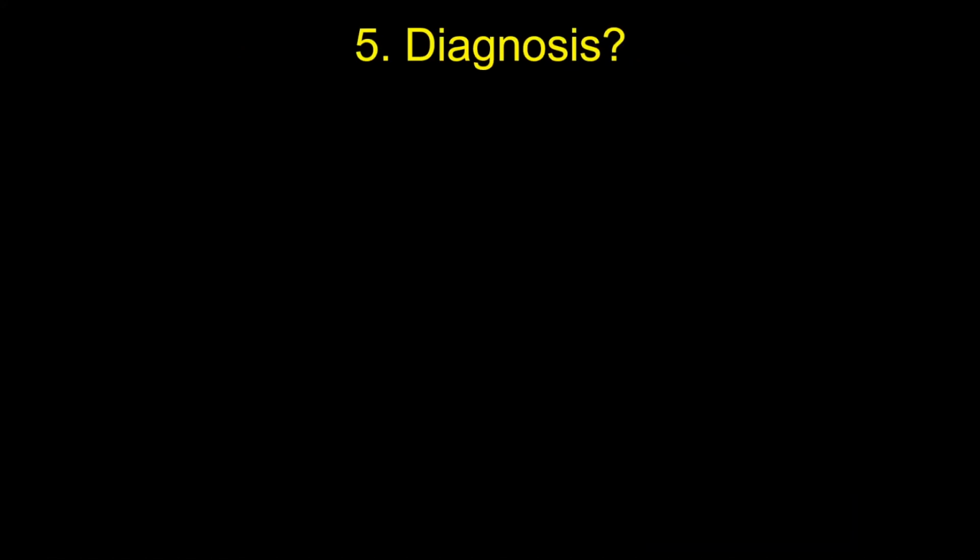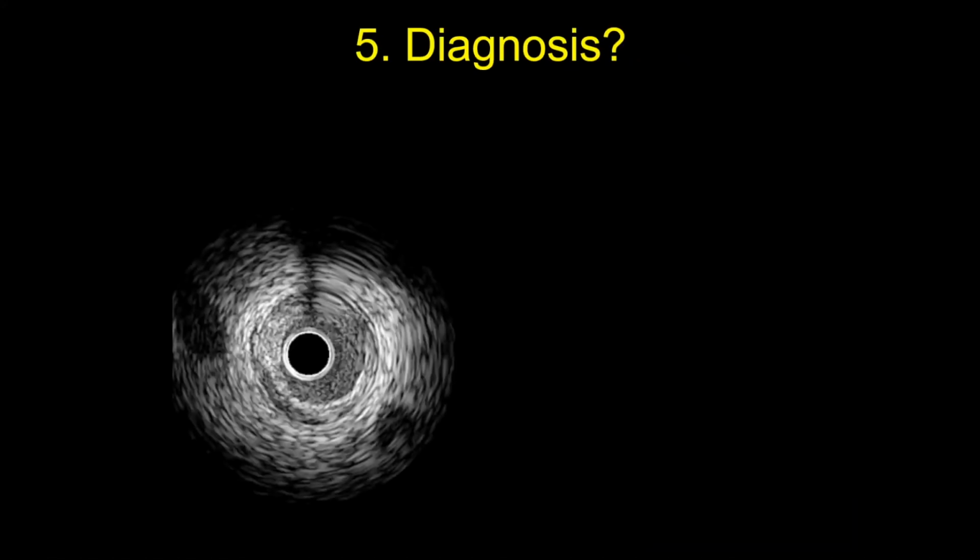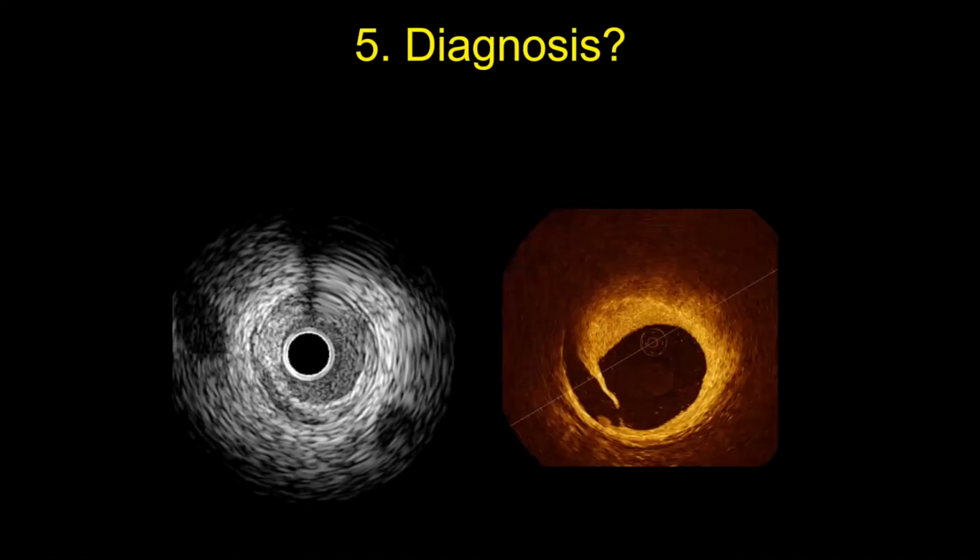Okay. So Professor Ahmed is not there, but you know. Can anyone want to comment on it? On the IVUS, when I'm looking after this OCT, I can make it, oh yes, there is something going on there, but I would have struggled. Is it this, is it something else? It is dissection. Yeah. That's why I'm saying, Professor, you would be able to see it easily on IVUS as well. For me, the OCT is just making it easier.